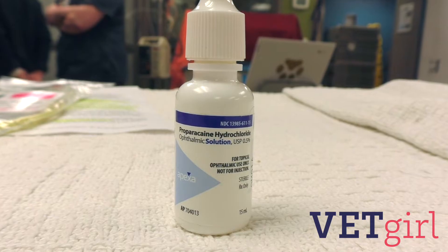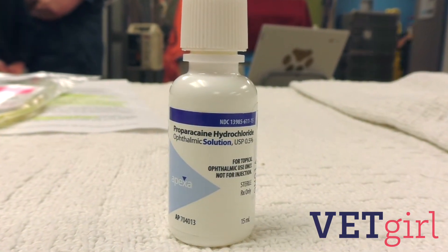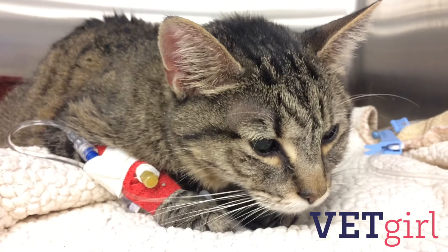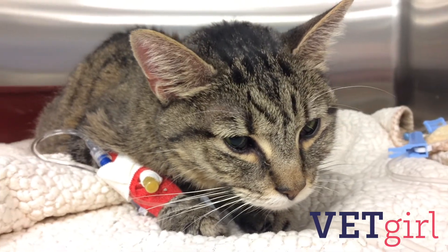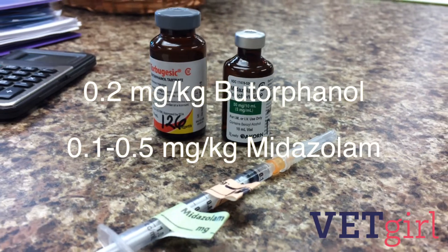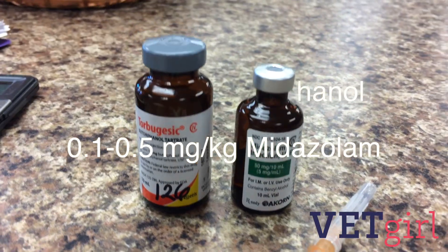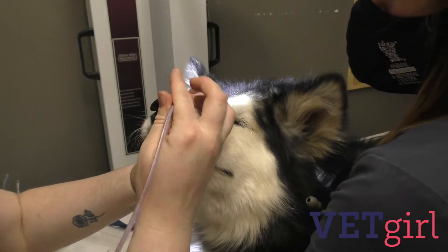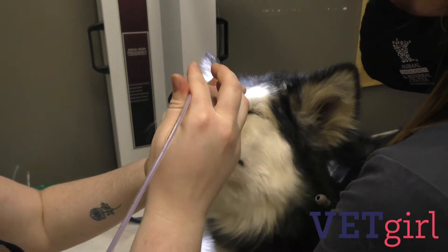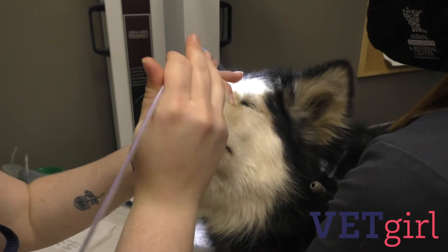As you prepare everything, place a few drops of proparacaine into the nostril to allow it time to take effect. Tip the nose upward to allow the anesthetic to coat the nasal mucosa. Light sedation may assist with placement, such as 0.2 milligrams per kilogram of butorphanol and 0.1 to 0.5 milligrams per kilogram of midazolam. Try to maximize your sedation by utilizing it for the actual insertion of the NG tube versus initial preparation.